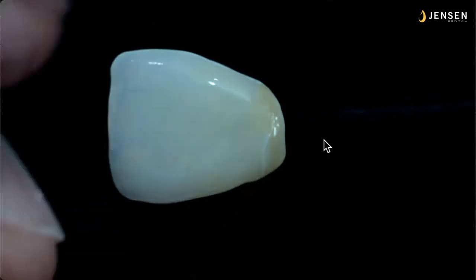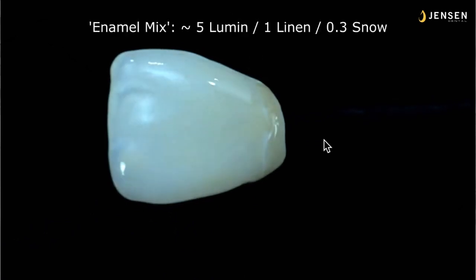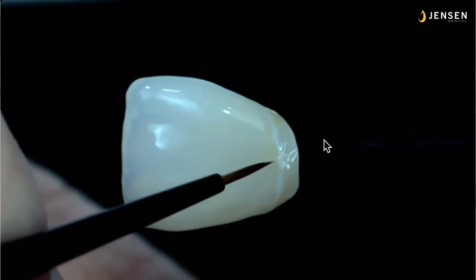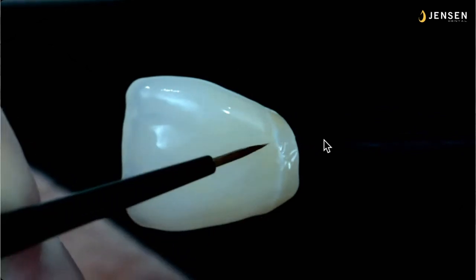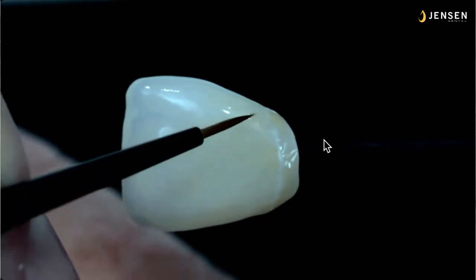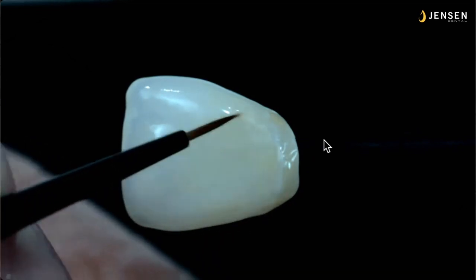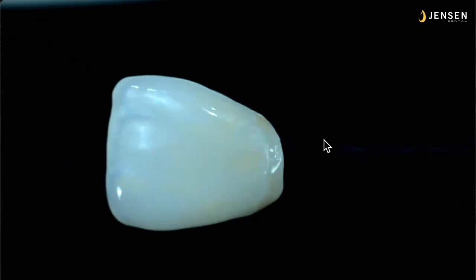So I put a little hypocalcification at the edge of the CEJ or cemento-enamel junction. And again, it slides right off. Now I normally use my enamel mix because it's very subtle, 5 parts lumen, 1 part linen, and about 1/3 of a part of snow. Make sure you mix up those colors before you dispense. And then I take that edge of the white and I pull it down. Now when this fires, this will be very, very subtle. It'll just give a slight translucent glow right at this edge right here. It'll be very translucent. But you see it kind of differentiates the root section, just gently.